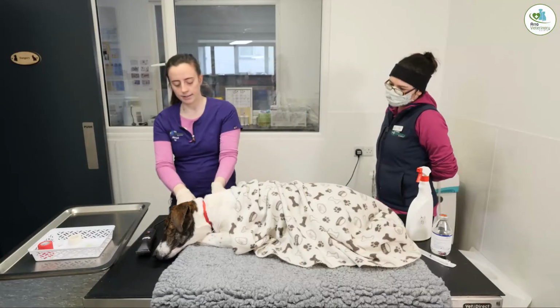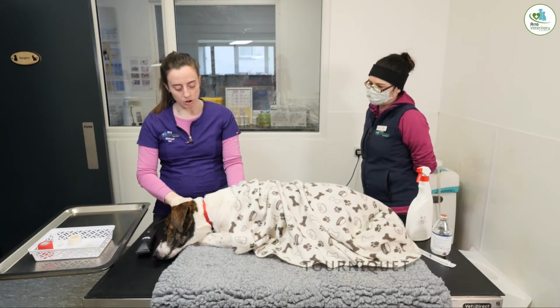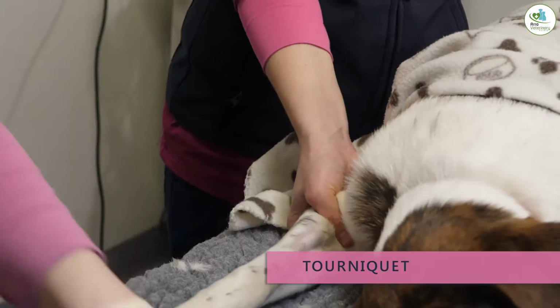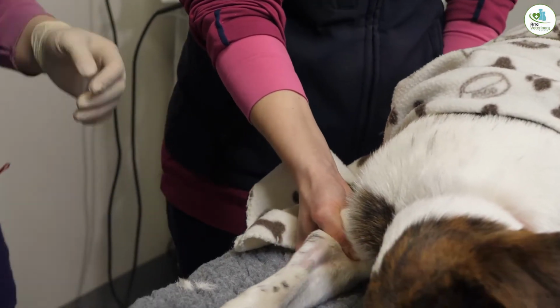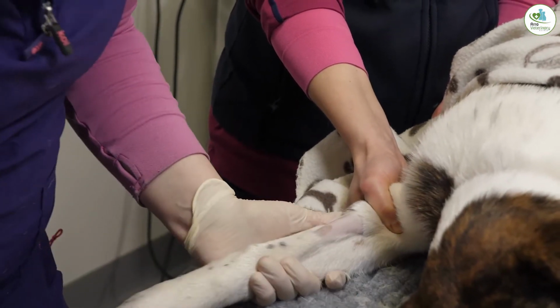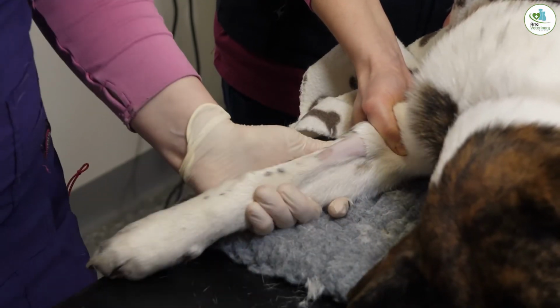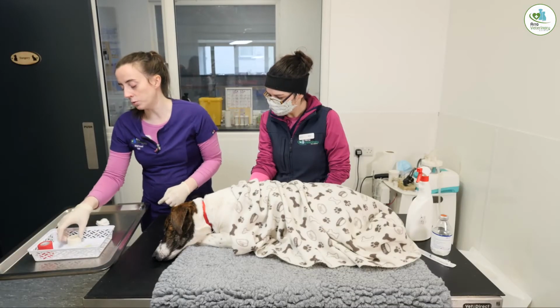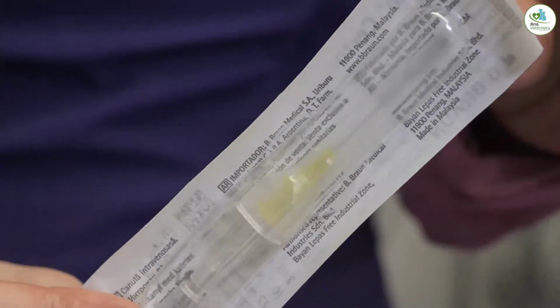And then you need to have either a tourniquet or an assistant to hold it up. So Anya's going to help us here now. She's going to hold up the vein for it. We'll just move the clippers out of the way. Now, we give it a clean with our surgical spirits, and then you can have a little look to see what kind of size vein you're dealing with. So we have two cannulas here, so I'm going to go with the smaller one for Covey today. So this is a 24 gauge one.